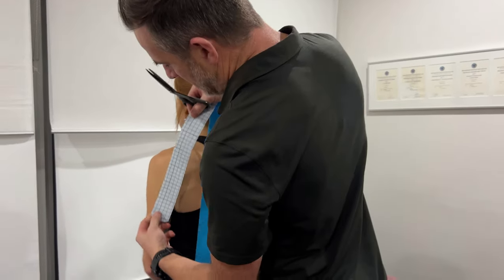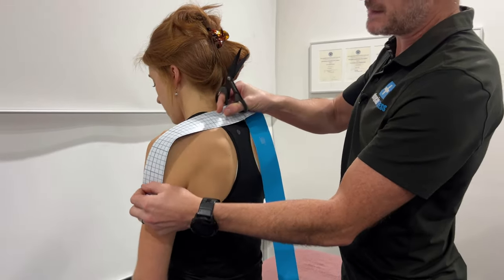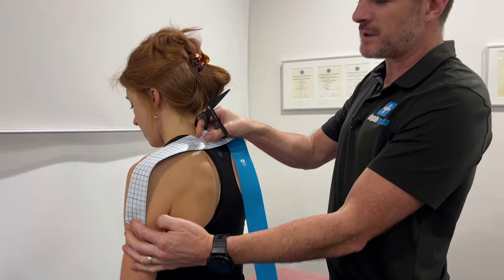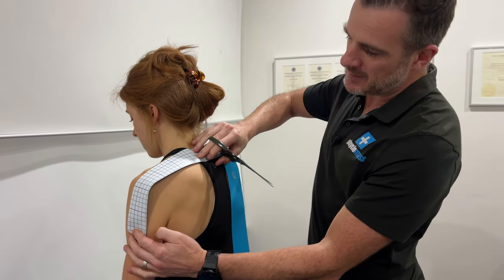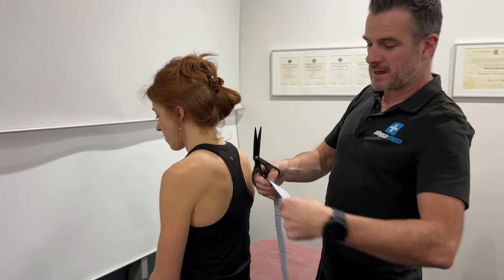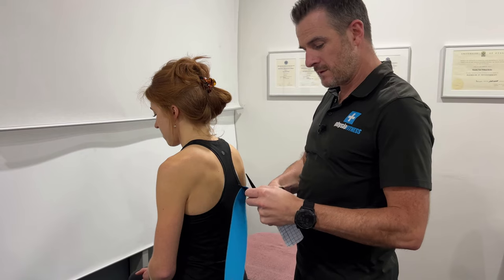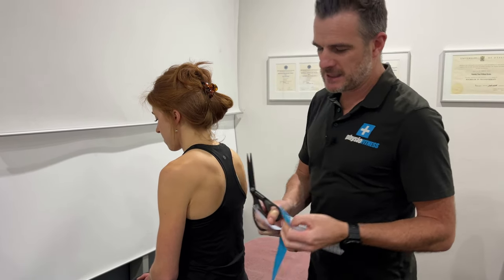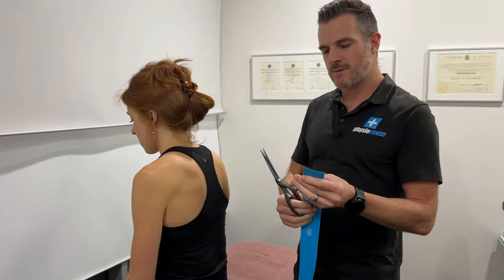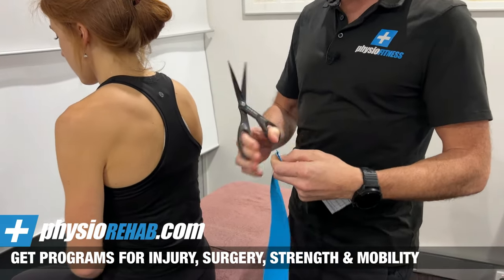First thing you've got to work out is how much tape you need. You might measure and think you need a certain length, but you've got to remember you're also going to stretch it, so you don't need as much. You need to go shorter. I'm going to use about four for her, and I need three of these because I'm going to go from the middle, the front, and the back of her shoulder.